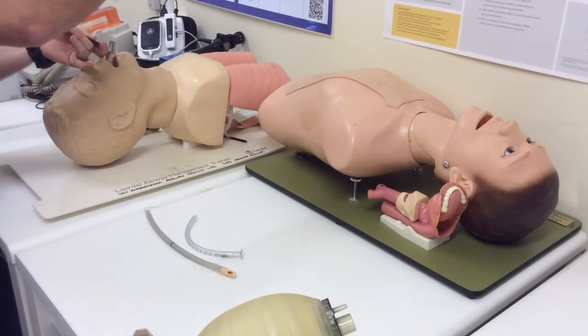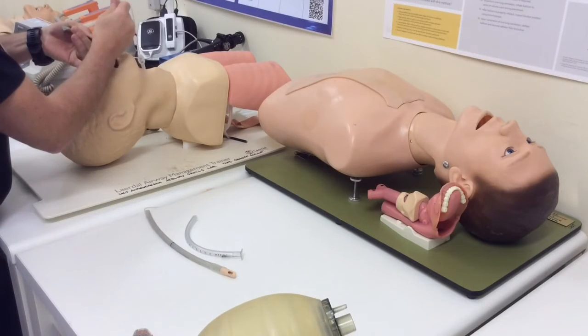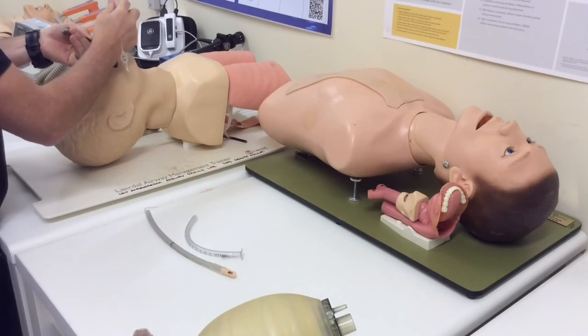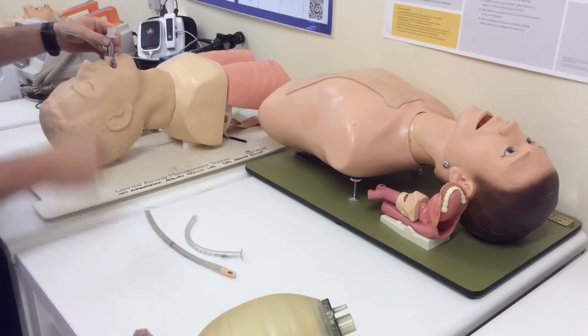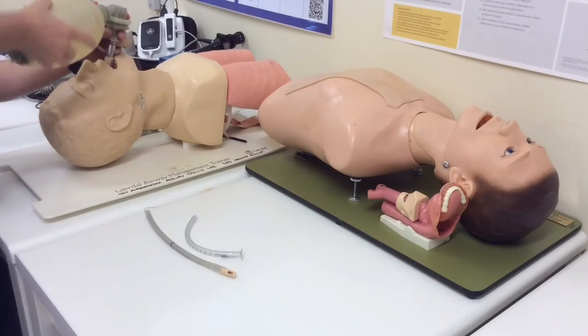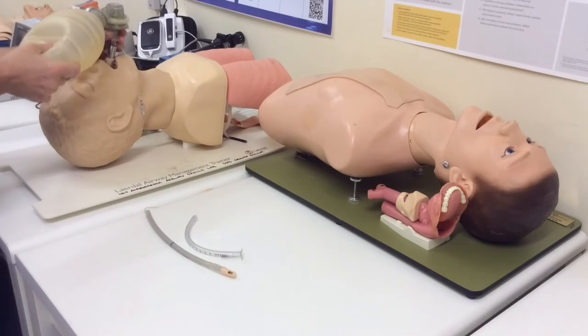And then I'm going to pass my endotracheal tube with a black line that's on the tube facing towards me. This is all nicely described in the product literature, and I'm going to advance it. I often feel a slight moment of a hold up as it goes through the vocal cords, and then I can inflate the tube's cuff and I can start to ventilate. And there it's in. Now the situation is saved and resolved and my patient is safe.